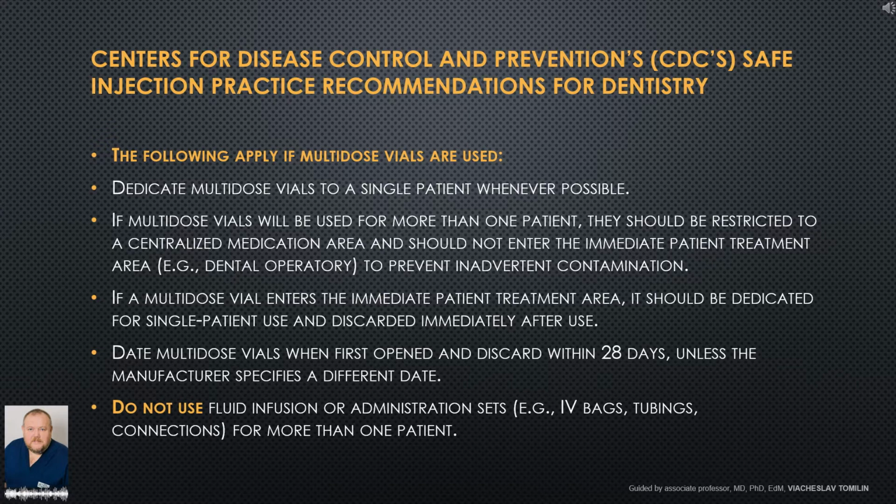If multi-dose vials will be used for more than one patient, they should be restricted to a centralized medication area and should not enter the immediate patient treatment area, for example, dental operatory, to prevent inadvertent contamination. If a multi-dose vial enters the immediate patient treatment area, it should be dedicated for single patient use and discarded immediately after use. Date multi-dose vials when first opened and discard within 28 days, unless the manufacturer specifies a different date. Do not use fluid infusion or administration sets, for example, IV bags, tubings, connections, for more than one patient.